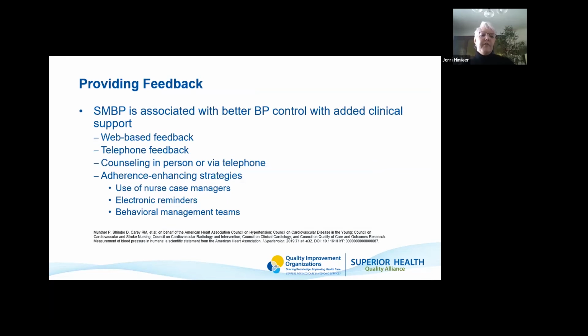So when you're providing feedback, SMBP is associated with better blood pressure control, and it adds clinical support. So there's different things that you can use when you're providing feedback. You can give web-based feedback to your patients. You can provide it over telephone.